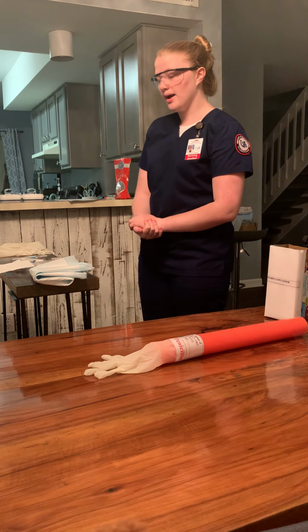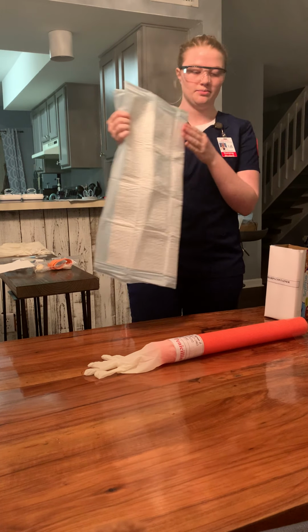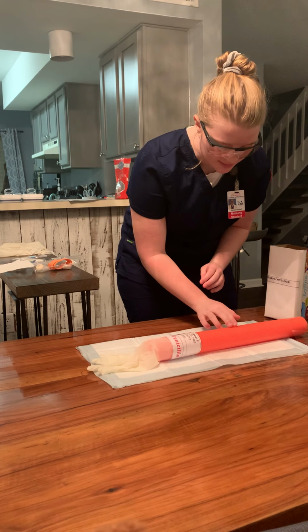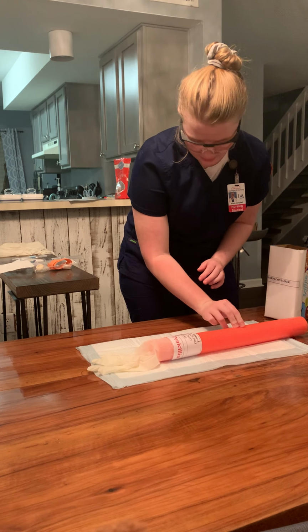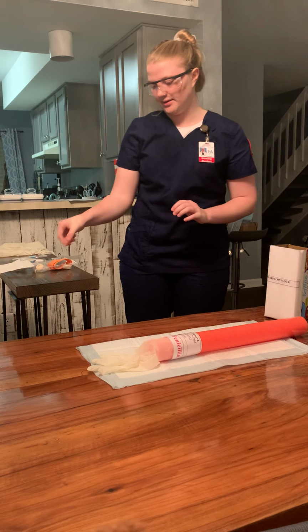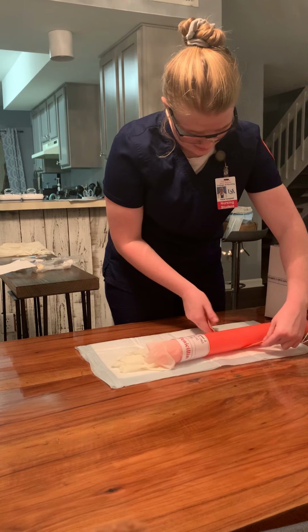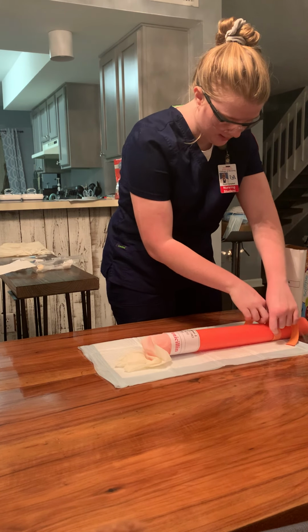And so now I'm going to take my waterproof towel and put it under my patient's arm, and then I'm just going to assess for a vein site. And I'm going to take my tourniquet and apply this 4 to 6 inches above where I will be inserting my IV.